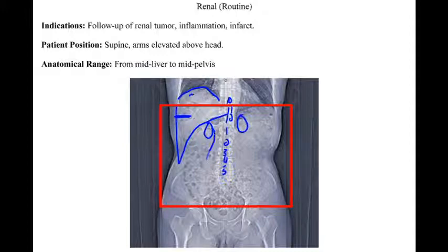And so the ureters are going to be running down, doing something like that. And so you're going to go to mid-pelvis. You can actually get to right above the acetabulum and still be pretty much in the abdomen cavity. But notice that this is really not bound by these type of rules. So you're actually scanning from this area.